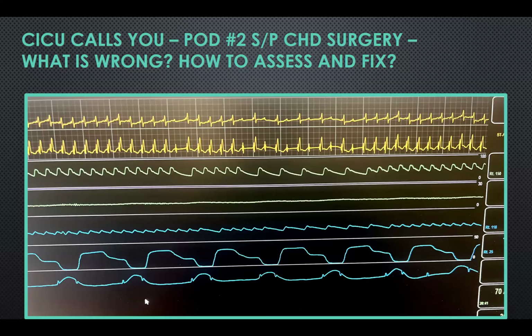I mean, basically, the leads are put in to work, but remember that another important aspect of these leads is they need to come out at the end of the hospitalization. And so the surgeon intentionally doesn't sew them very tightly to the heart. I put pacemaker leads in, but I think we would all agree that Peter Pastushko is a much better surgeon than I am, but his temporary leads don't work as well as my permanent leads. And the reason is because he is intentionally not sewing them very aggressively to the heart.